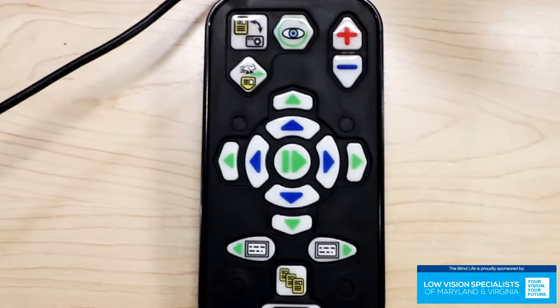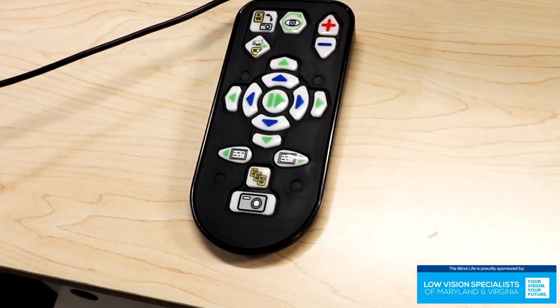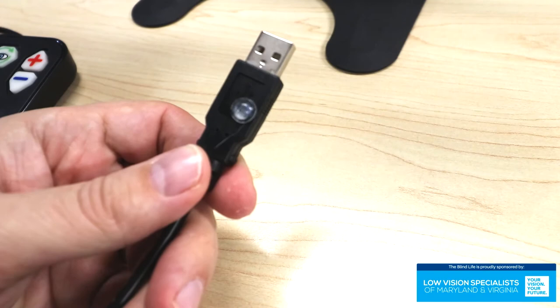The buttons are very high contrast and very tactile, so it's easy to find just by feel. With this controller I can zoom in, zoom out, change the contrast, change the colors, take a picture, change the reading mode, and change the way it's displayed on the screen. You have a lot of options for controlling the device with this provided remote. Another nice little touch is they even put bump dots on the USB so you know exactly which way to plug it in — no more fumbling with the plug, flipping it upside down and right side up trying to find the right way it goes in.